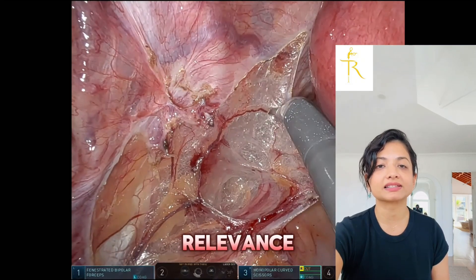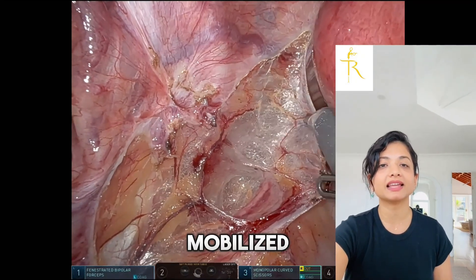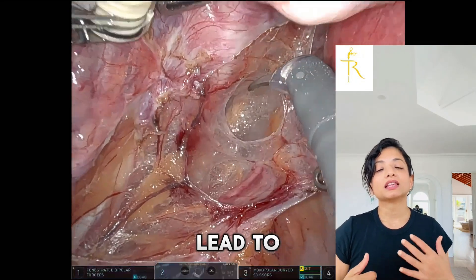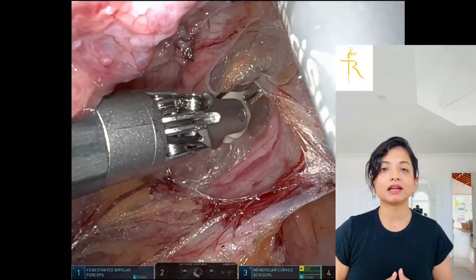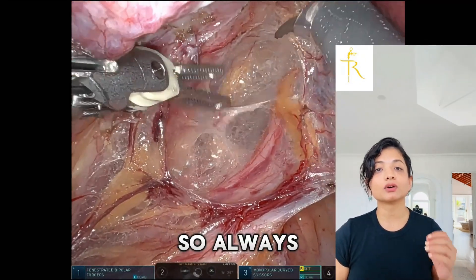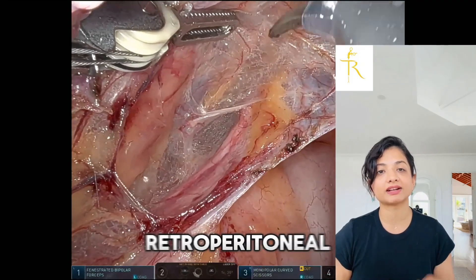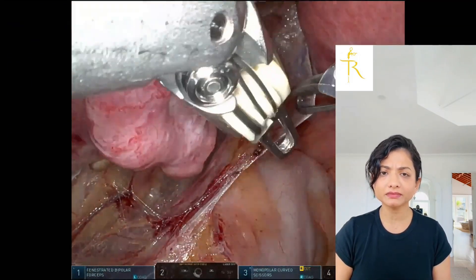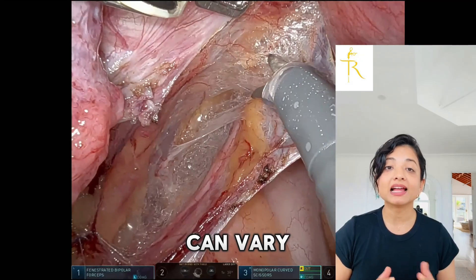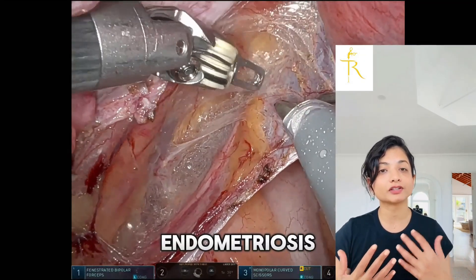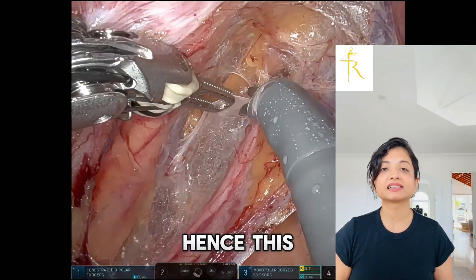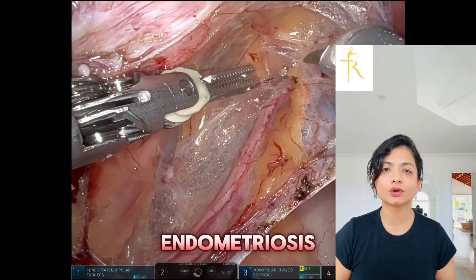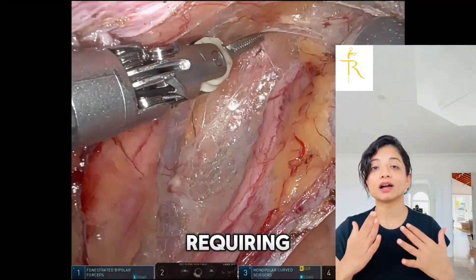Now that we've successfully mobilized the ureter, let us discuss some important clinical relevance and pitfalls. Excessive use of energy can lead to thermal injury inadvertently near the ureter. Misdirecting the dissection plane is also a risk — always use anatomical landmarks to stay in the correct retroperitoneal space. Not recognizing natural anatomical variations is another concern, as the ureter's position can vary especially in cases of large fibroids, endometriosis, or previous surgeries. This approach is particularly useful in deep infiltrating endometriosis where the ureter is often encased in fibrosis requiring careful dissection.